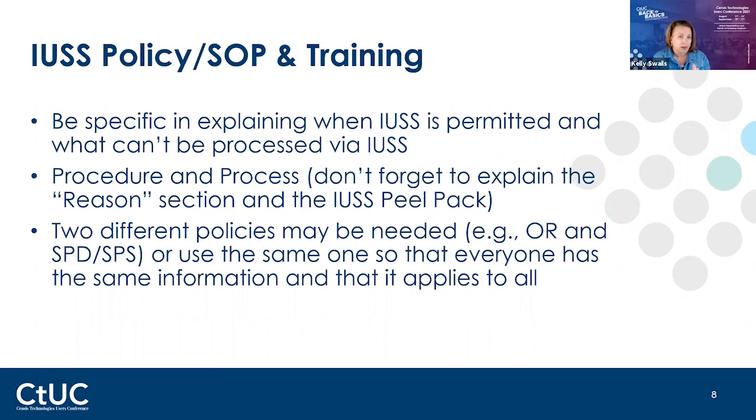So then when it comes to your policies, you may need to write separate ones for your OR and your SPD or SPS versus using the same one. Yes, everyone needs that same information, but at the same time, that OR one, you also want to be careful about how it's written.